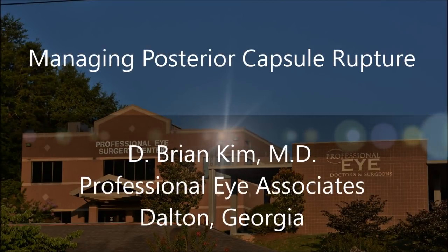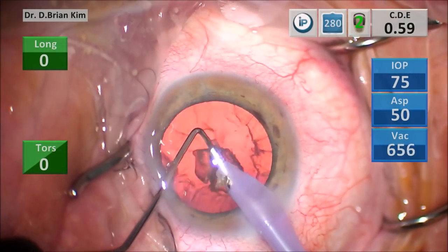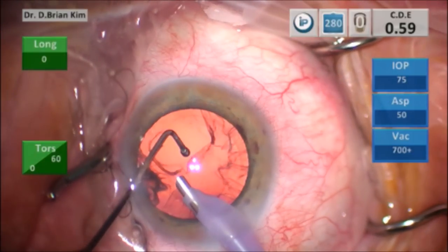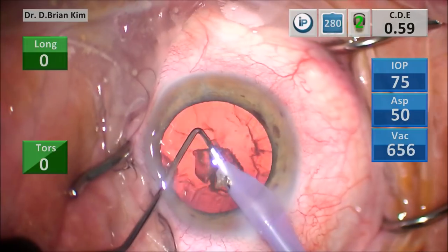I'd like to share with you a case of posterior capsule rupture and how I managed it. So this is the last fragment I'm removing, and as I am removing it, right here you can see there's an ovalish hole right over where the chopper is. And so I broke the bag here, and I'm going to show this under slow motion.